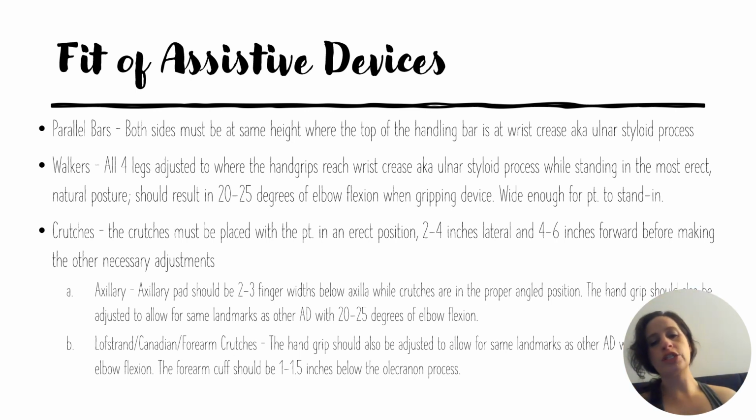So the crutches is the one that you probably have to put a little bit more effort into knowing all the numbers and all the specifics of them, which are listed here in the slide, as well as, of course, your books.